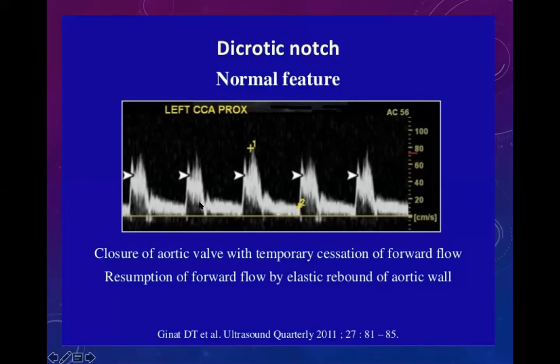And then this is the third part of the triphasic form that you see here. So this is not actually going down and up like in the femoral artery. So this is the normal waveform of the carotid arteries. So both the waves are above the baseline. Yes, you can have a little going down like this, but not that characteristic QRS kind of a wave that you see in lower limb arteries.